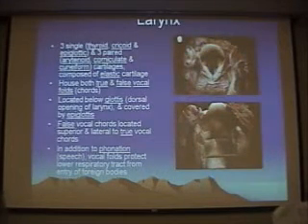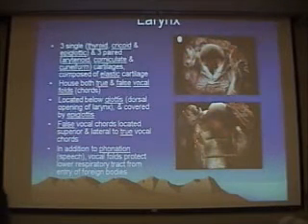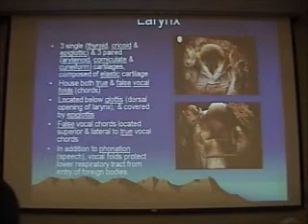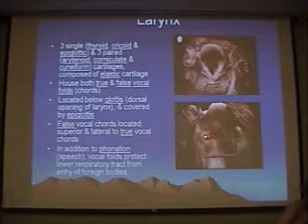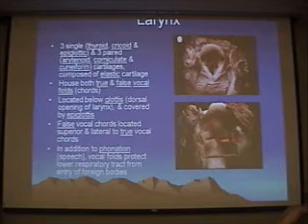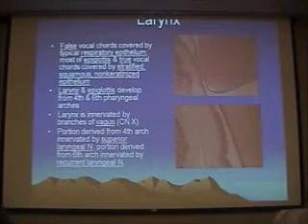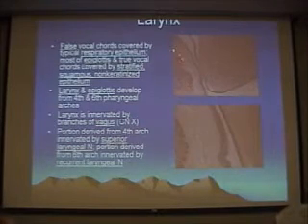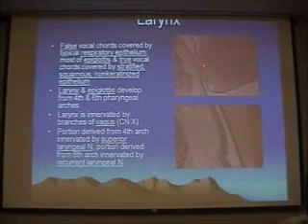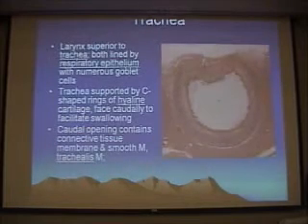In the upper respiratory tract, the larynx is the voice box, has the epiglottis. It houses the vocal cords. Remember, there's true vocal cords and false vocal cords. The false vocal cords are located superior and lateral, so they're up here and over here, whereas the true vocal cords are inferior and medial. They have a different type of epithelium covering them. So there's a respiratory epithelium covering the false vocal cords, whereas the true vocal cords have a squamous non-keratinized epithelium over them. Then we have differential innervation by vagus nerve.